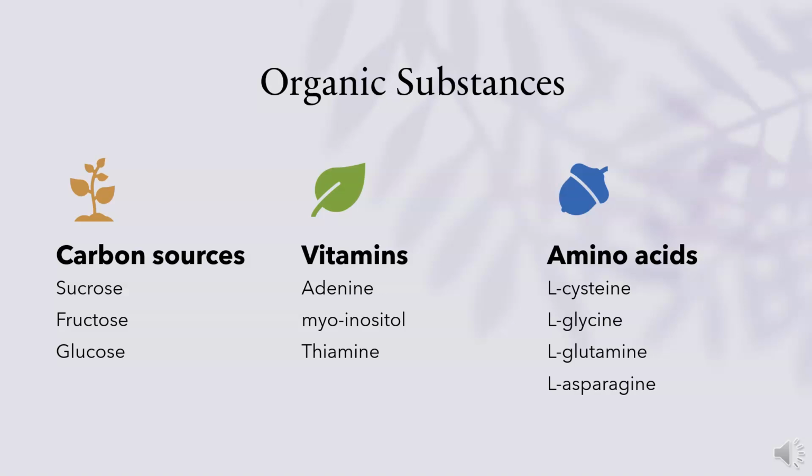Vitamins are organic substances, required for metabolic processes as cofactors, or parts of enzymes. Therefore, for optimum growth, the medium should be supplemented with vitamins. Adenine, vitamin B4 or 6-aminopurine, is important to cells, as a component of nuclear substances, DNA and RNA. It is used in culture media as adenine sulfate to promote shoot formation.